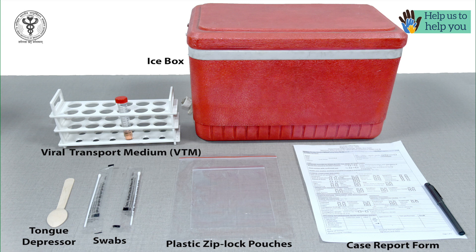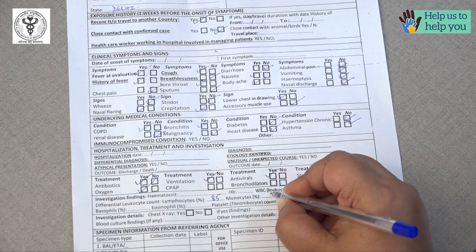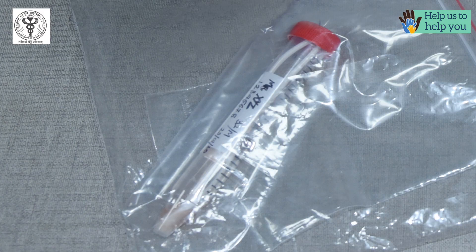Apart from these, we need tongue depressor, two swabs, viral transport medium, two plastic pouches, icebox and forms. Fill the patient's form and label the vial.